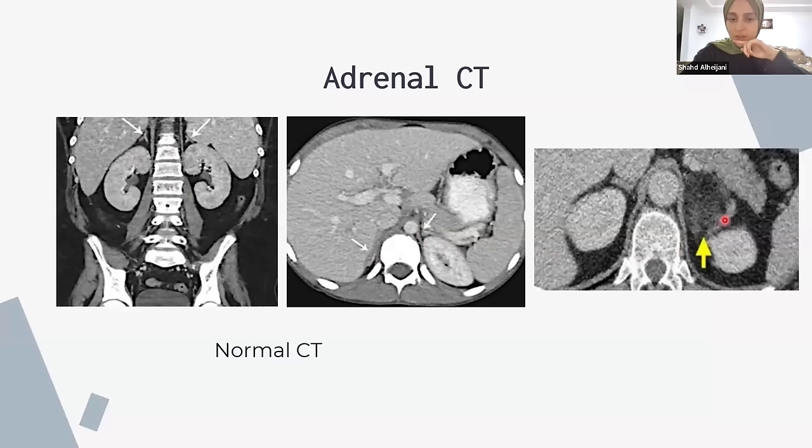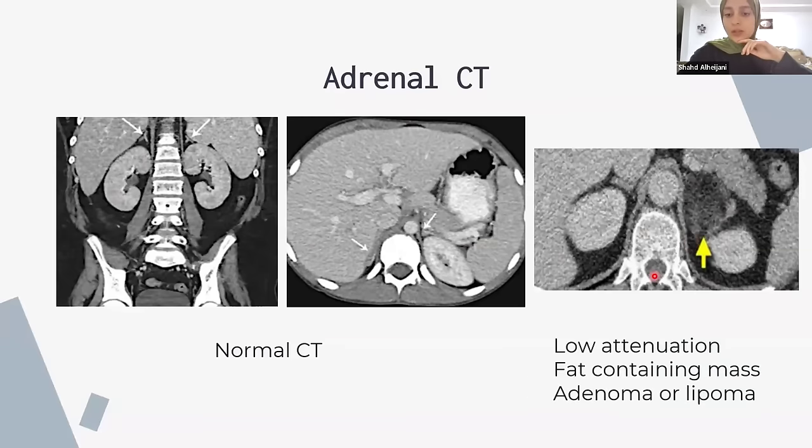Okay, and here, look at this. This is supposed to be an adrenal gland, but something is happening here. What do you think is going on? Mass, yes. Okay, tumor, mass, tamam.